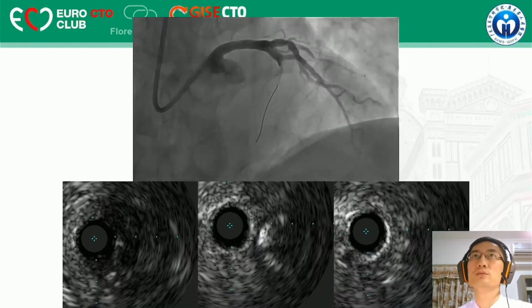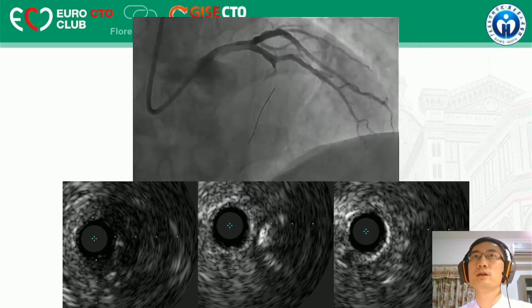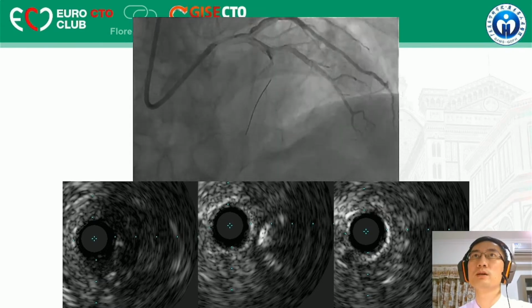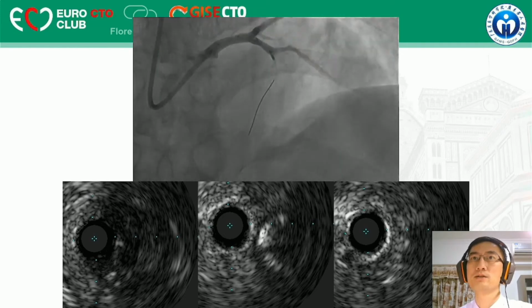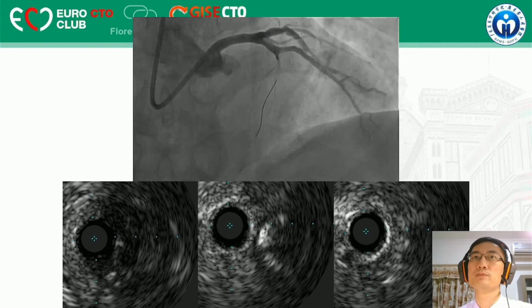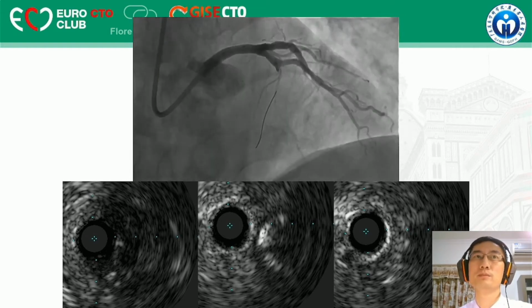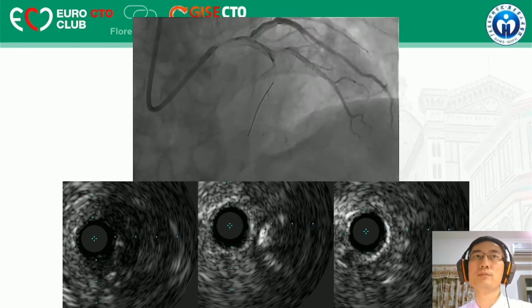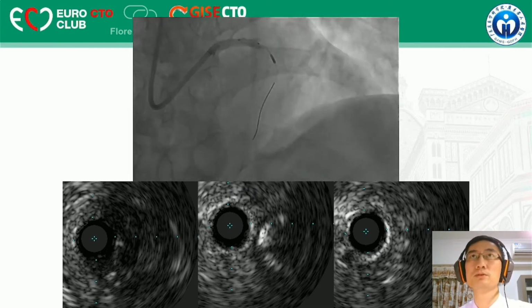So we turn to the septal. We pull back distally around here, just below the ostium of the diagonal. We can see something. No matter the size or the position or the shape, here it must be the occluded LAD. And a little bit of pullback, this must be the good point to enter. I mean, to attack with the wire. So this is the good news.